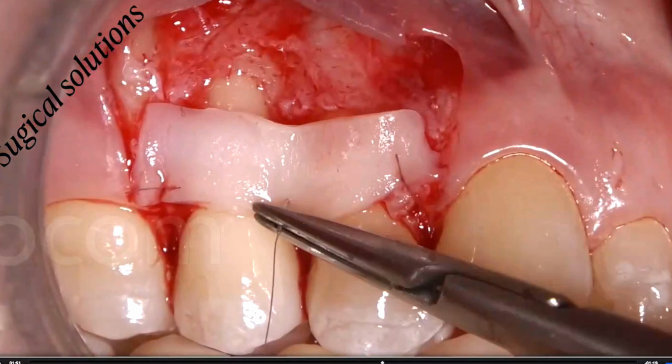Now, when you fix the connective tissue graft at the level of this papilla, you cannot use the single interrupted suture. Since this papilla is so palatally displaced, if you make a single anchorage, the risk is that the graft goes too much coronal and you don't leave enough vascular bed for the surgical papilla of the coronally advanced flap. So you have to use the same suture technique that we use around implants, remember?